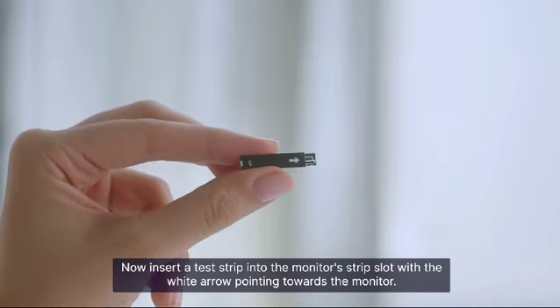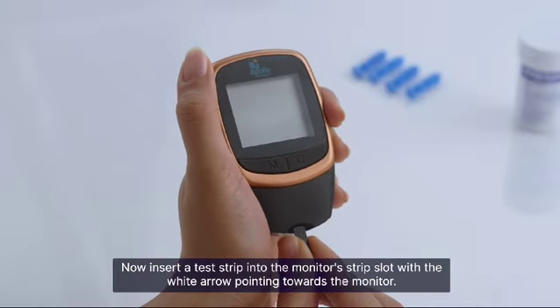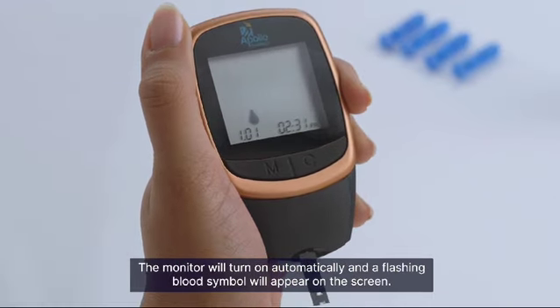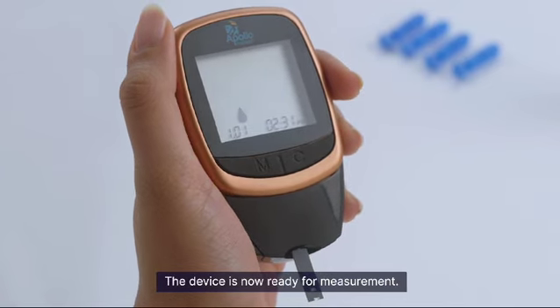Now insert a test strip into the monitor's strip slot with the white arrow pointing towards the monitor. The monitor will turn on automatically and a flashing blood symbol will appear on the screen. The device is now ready for measurement.